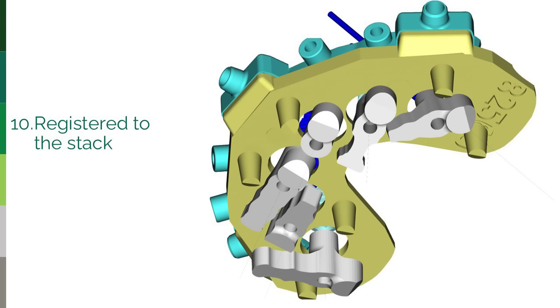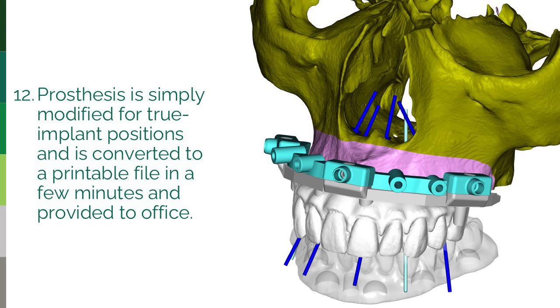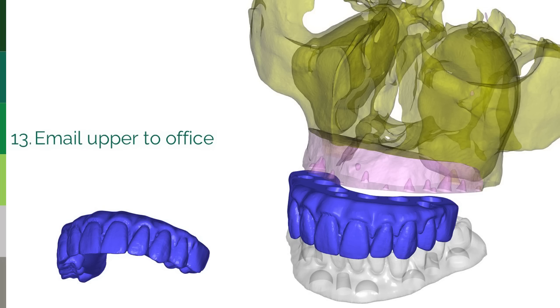Our laboratory has completed thousands of these cases now, really a leader in the market. And we have a full team. All they do all day is design full arch restorations. And you'll just go to the website, look up Grammetry, Photogrammetry, book your case, book your surgical guide, book your Combi guide, and then book your day of surgery, which is a very easy to use bookings calendar on our website.